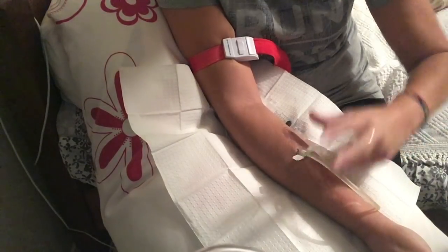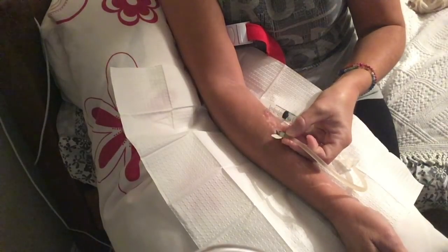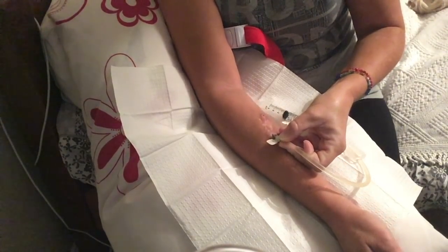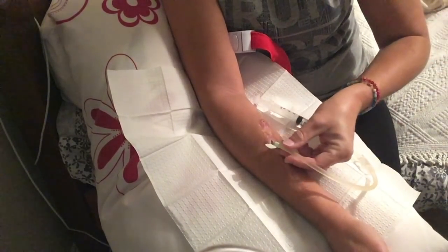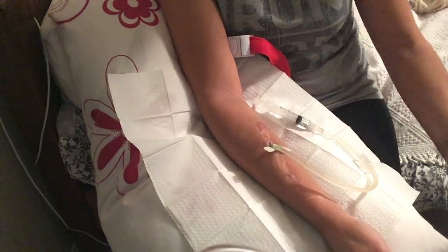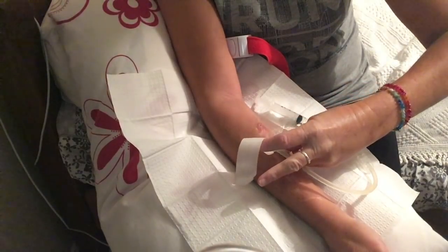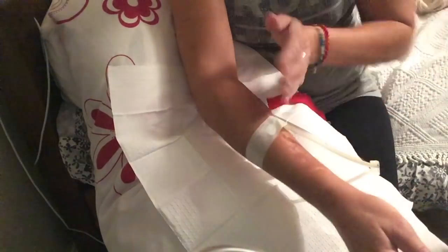That's in. I'll just release the tourniquet, and then I turn my needles around before I tape them. I just turn that over so it's properly in and make sure it's all the way through.